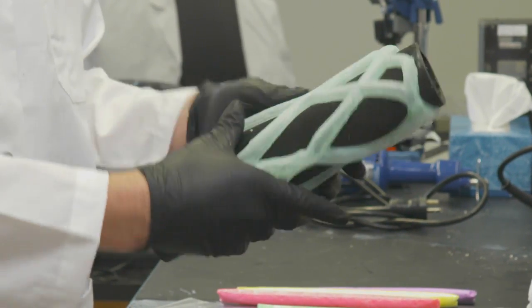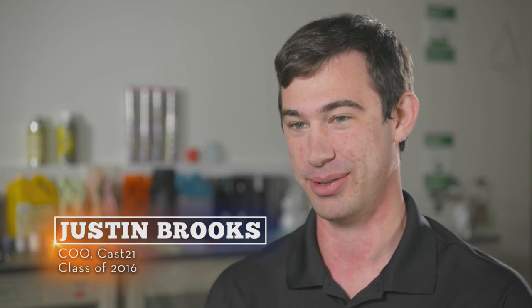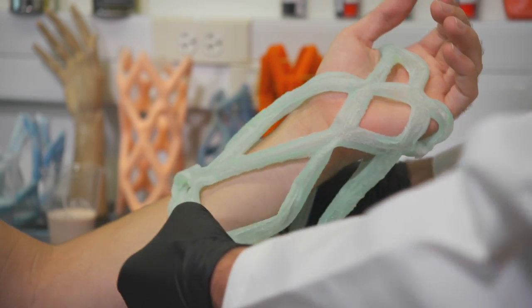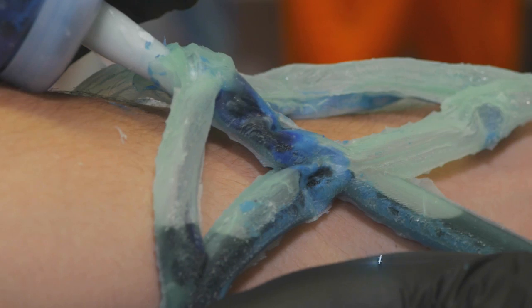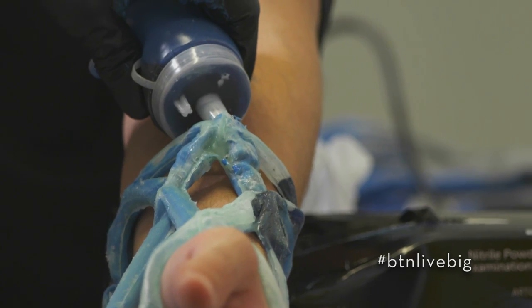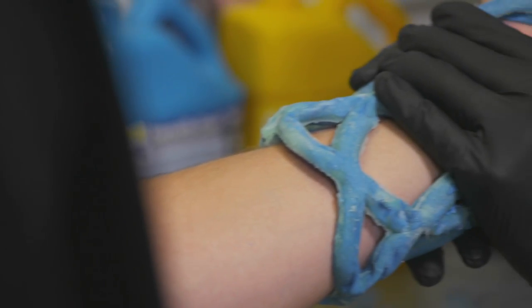We start out with this sleeve. If you picture a basketball net, but instead of rope, you're using silicone tubes. And once you have it exactly where you want it, you'll pour in a liquid, which will then fill in those tubes and harden within five to ten minutes.